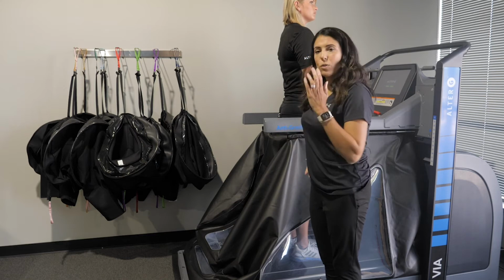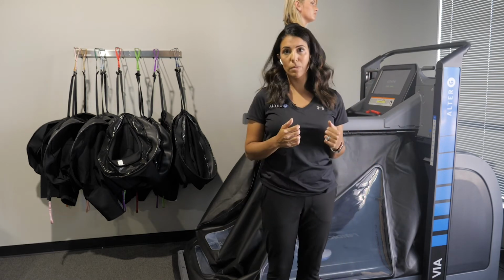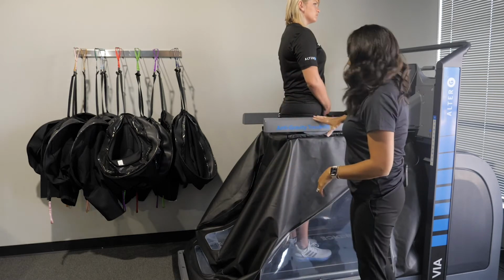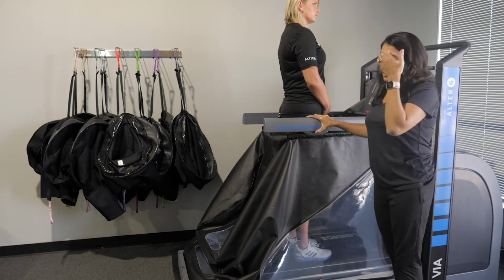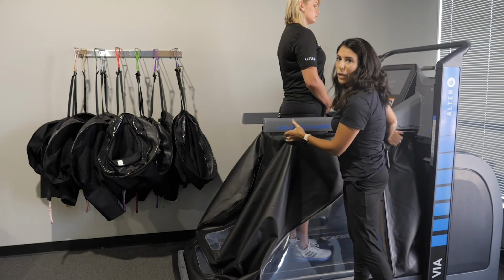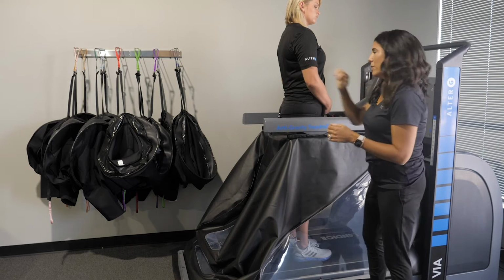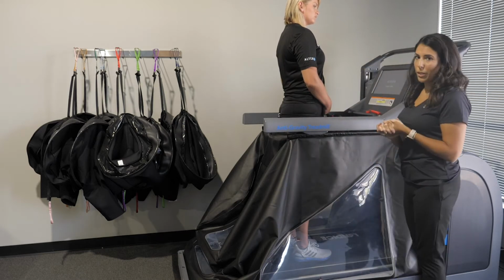If you have somebody that wants to work on some speed training, and incorporate some nice arm swing, you can keep this frame a little bit lower, a little lower than the greater trochanter. So it really depends on the goals of why you're using it. Once you're in position, you're simply going to lock the handle and then we're ready to go.